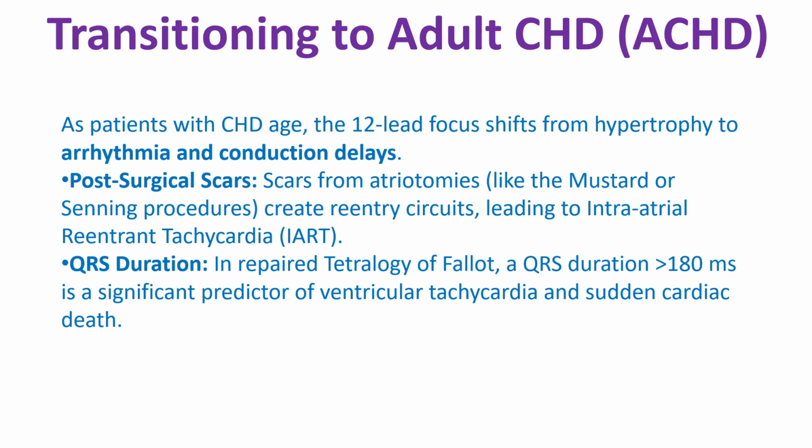As the congenital heart disease patient ages, the 12-lead focus shifts from hypertrophy to arrhythmia and conduction delays. Post-surgical scars from atriotomies like Mustard or Senning procedures create re-entry circuits leading to intra-atrial reentrant tachycardia. In repaired tetralogy of Fallot, a QRS duration of more than 180 milliseconds is a significant predictor of ventricular tachycardia and sudden cardiac death.